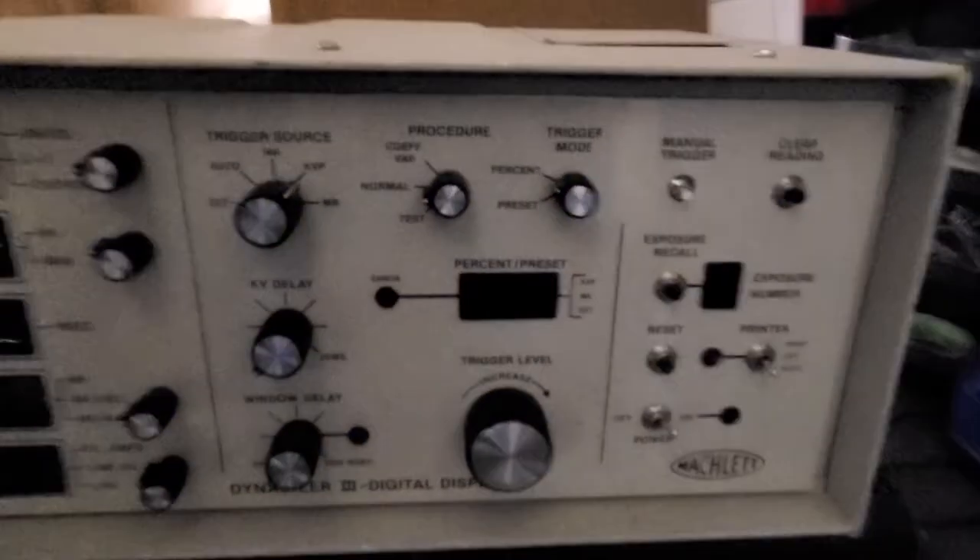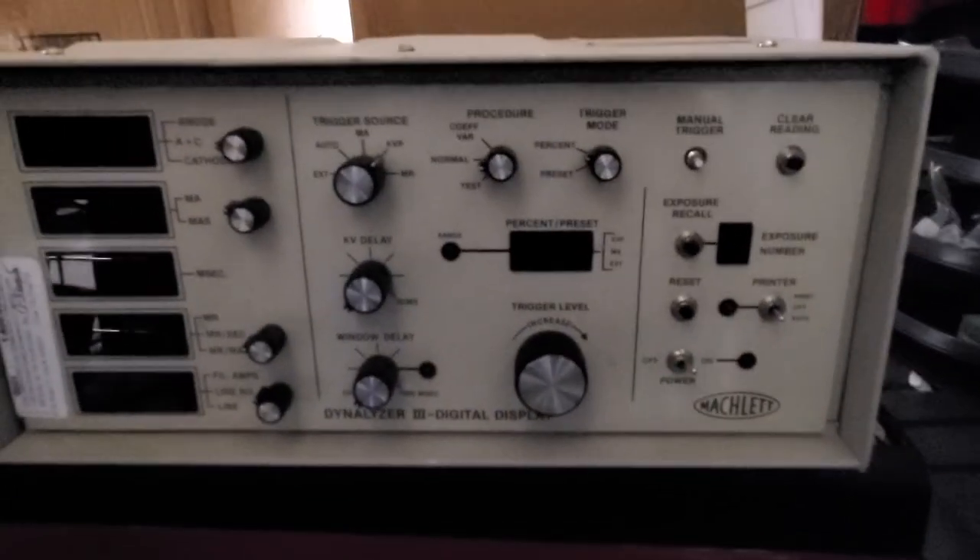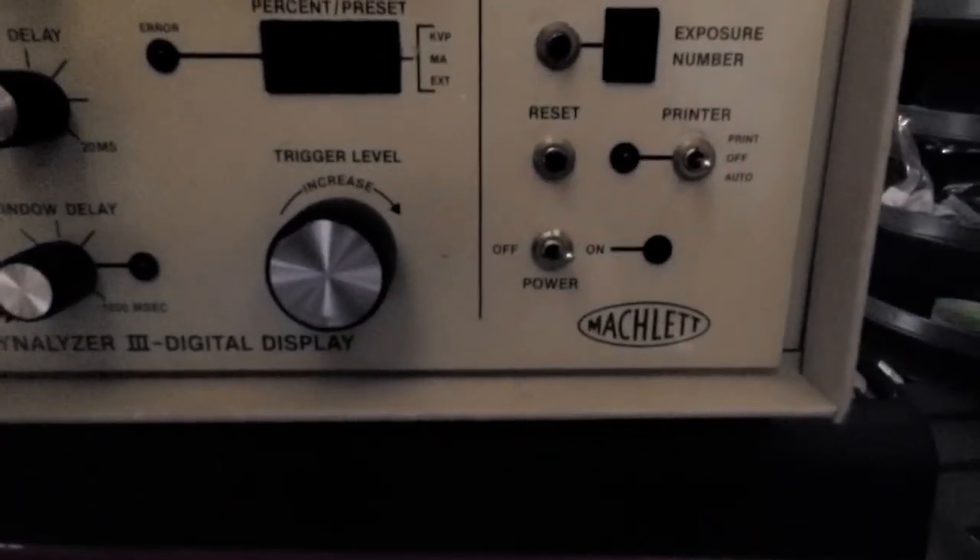Hey guys, welcome back. I'm in the dungeon and I'm trying to clean it out, and I just found a piece of treasure. Some of you new biomed folks have never seen one of these, but some of you old timers are gonna be shaking your head when you see this. Let's take a look.